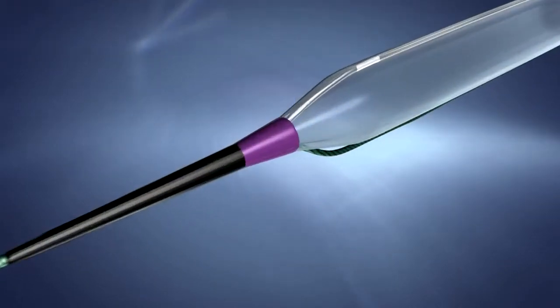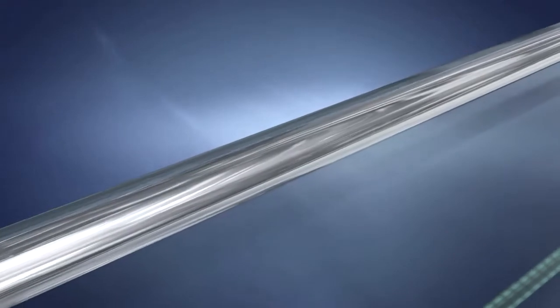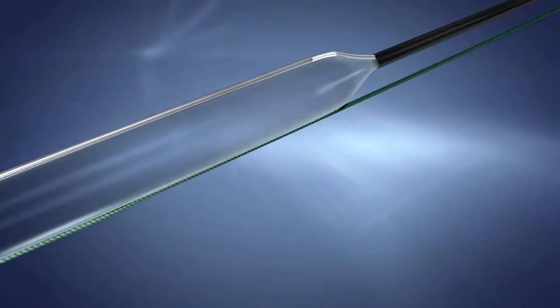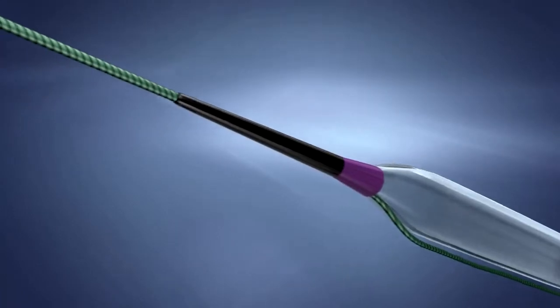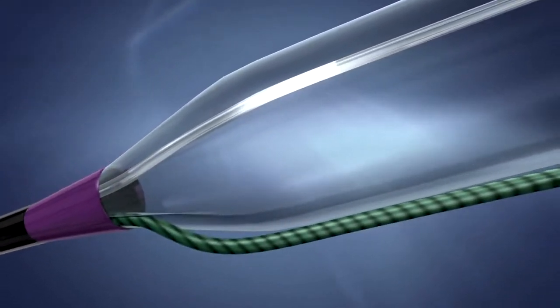The nitinol integral wire of the SCOREFLEX NC is a continuous component connecting the tip to hypotube, giving the device excellent pushability. The conventional .014-inch guide wire runs through a short, rapid-exchange system and exits immediately proximal to the tip.